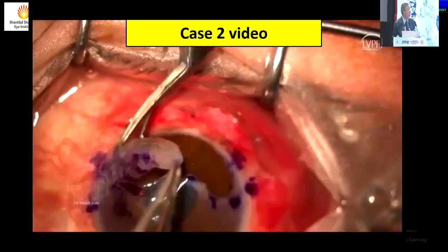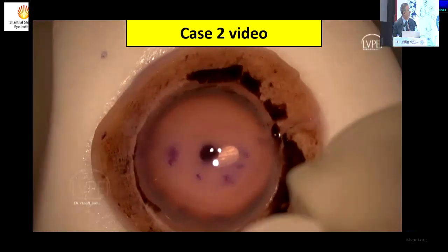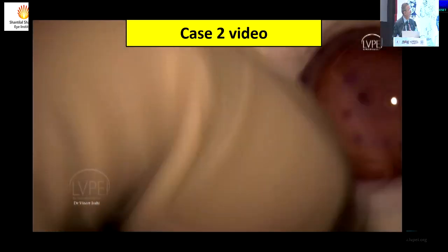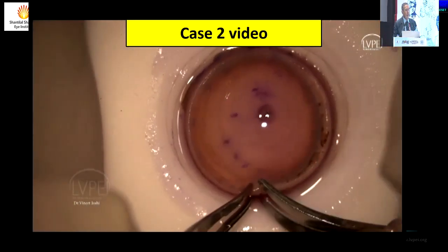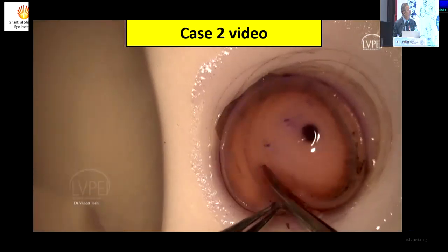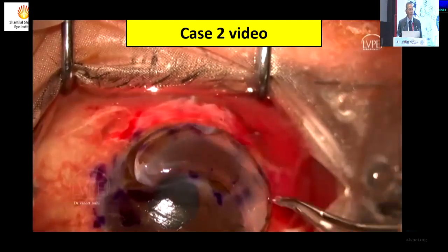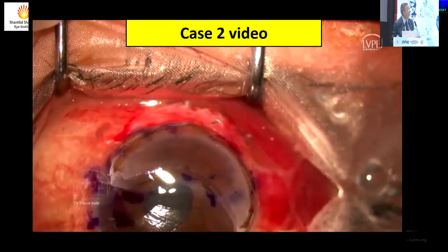See that you don't chop off iris at the same time. This is a disposable trephine. You can make 2 cuts, 2 different concentric cuts if you like, or you can do freehand. The second cut can be freehand. So I put it on the cornea, then mark it out accordingly, and then put this. You can always trim it afterwards, take a little larger piece.